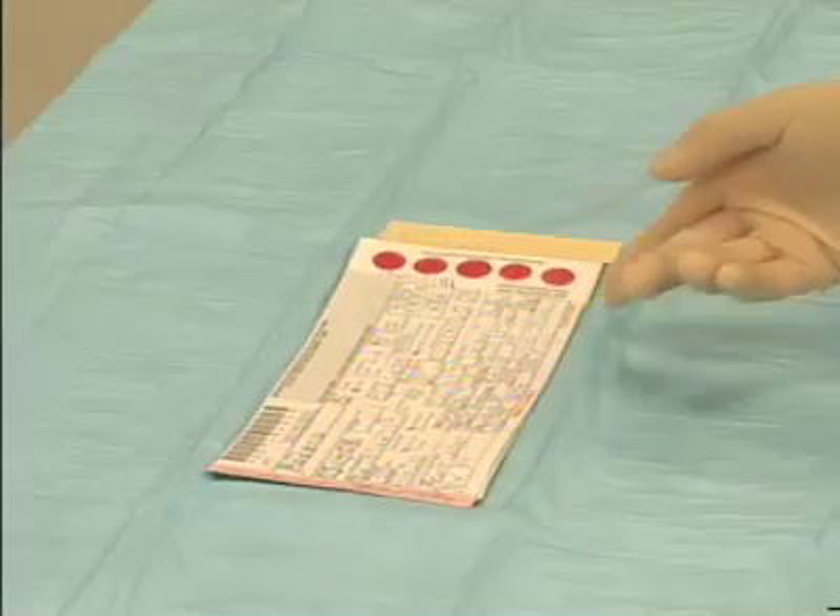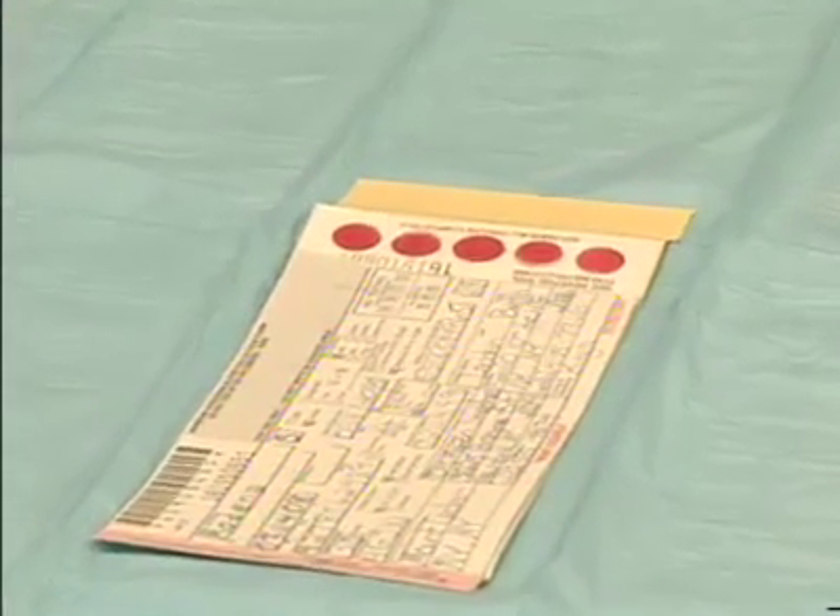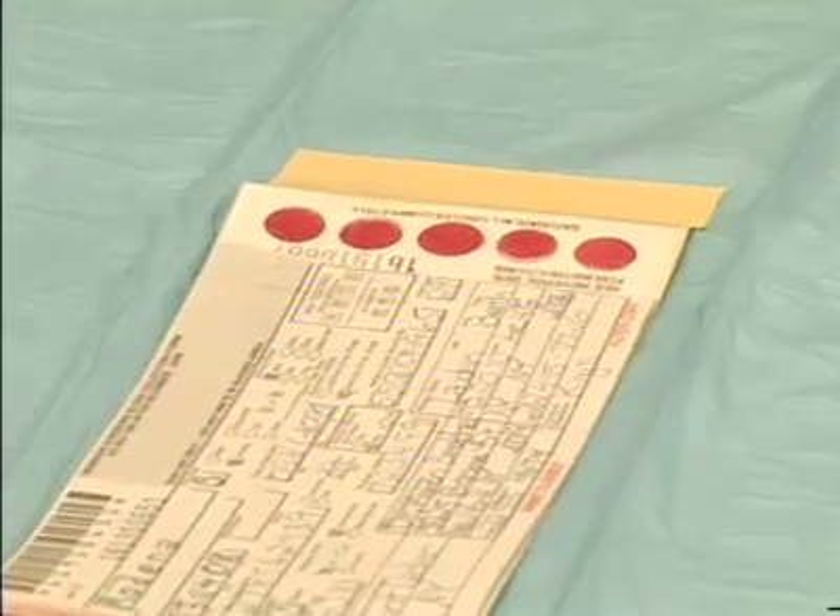Once the circles are filled, dry the blood spots on a clean, dry, flat, non-absorbent surface for a minimum of four hours. Remember, direct application of blood from the heel to the card is the technique of choice. Most newborn screening laboratories will not accept blood spots collected by a capillary tube, since the testing may not be accurate.